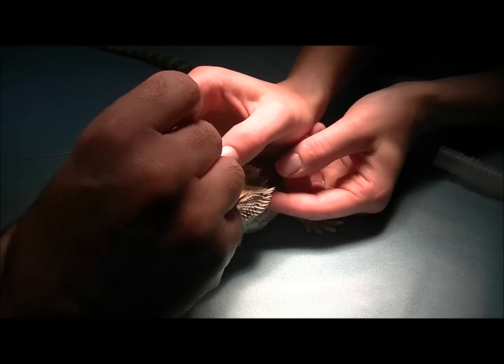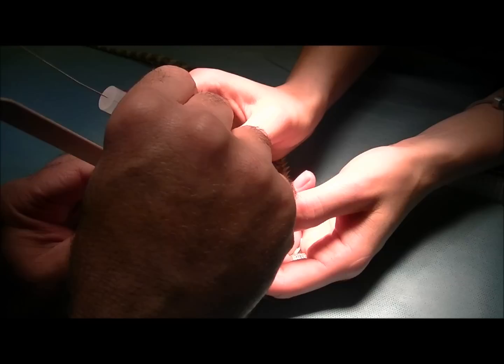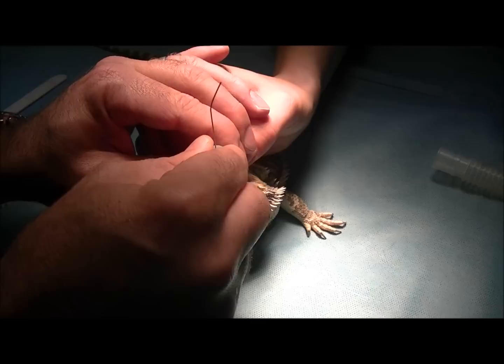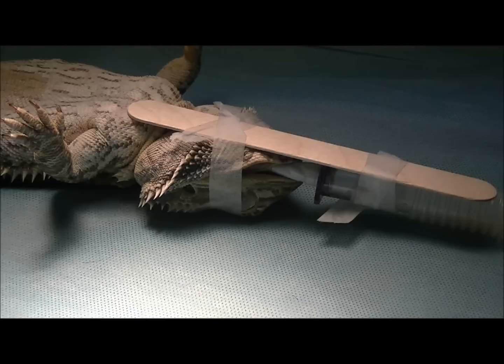It's a bit hard to capture on video exactly what I'm looking at because this tongue gets in the way. Sometimes we have to use a tongue depressor just to push the tongue down and out of the way. I'm visualising the windpipe, then pass the tube down, getting it a good way in so it's nicely in position. Take the stylet out — and that's how you put an ET tube into a lizard.